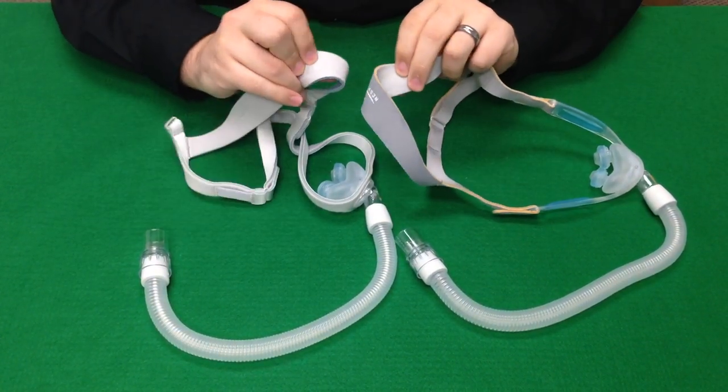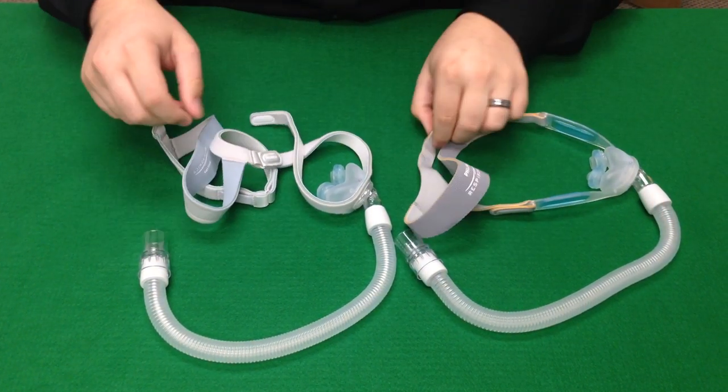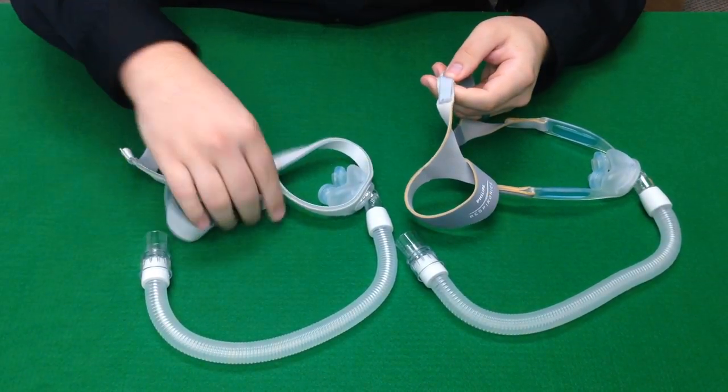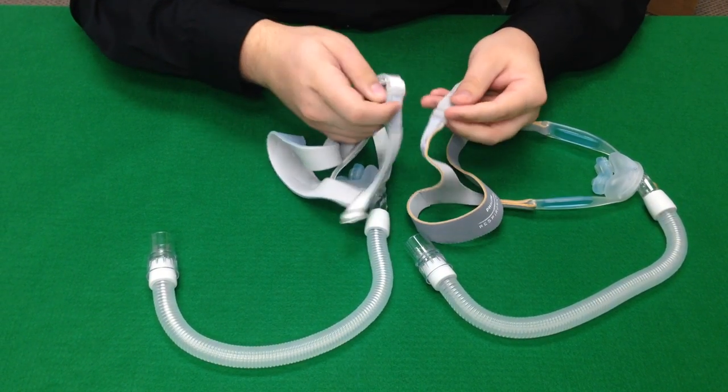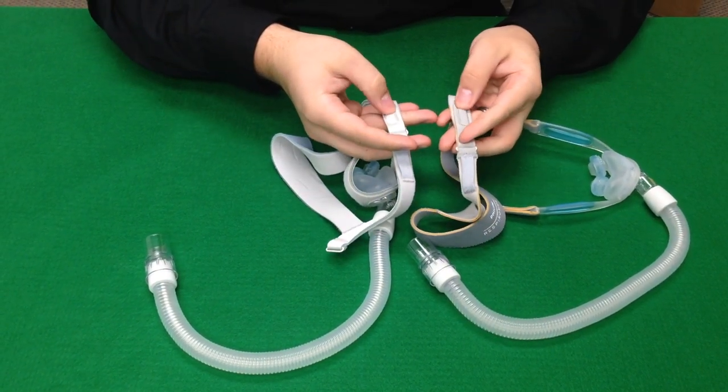Both have a non-slip backing, a tube retaining loop at the top for the hose to be inserted into so the hose can be routed over the head, and an adjustment crown strap.